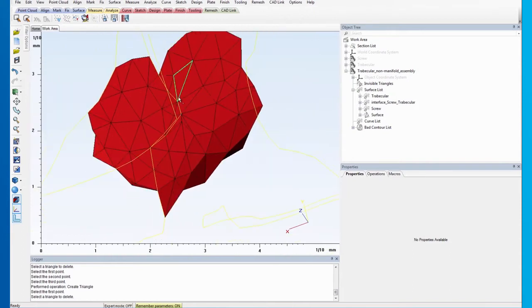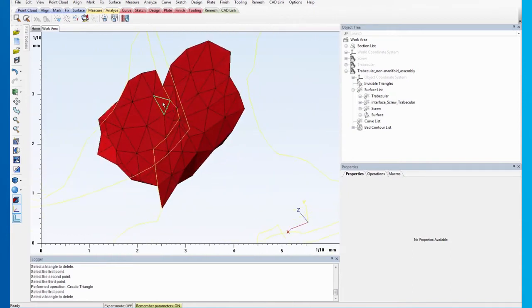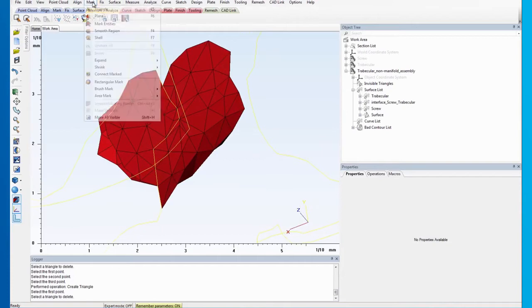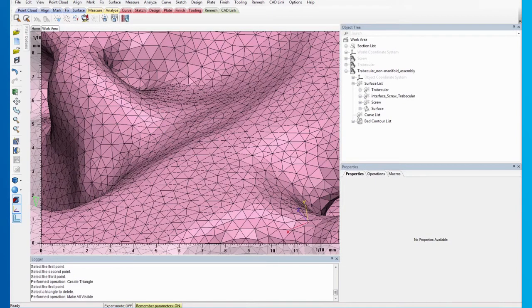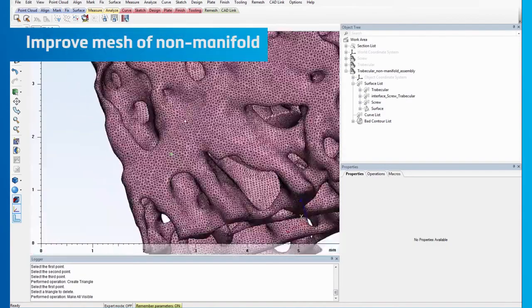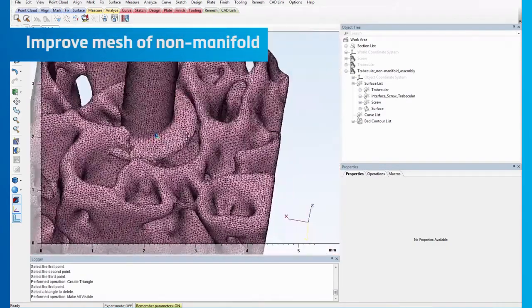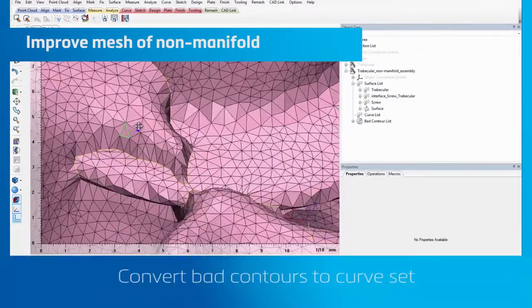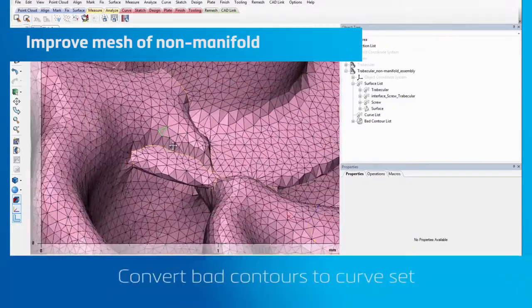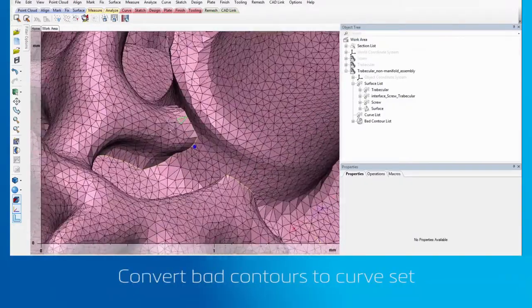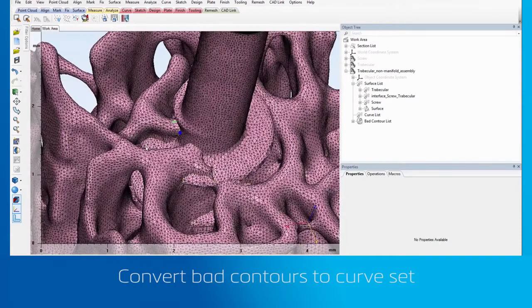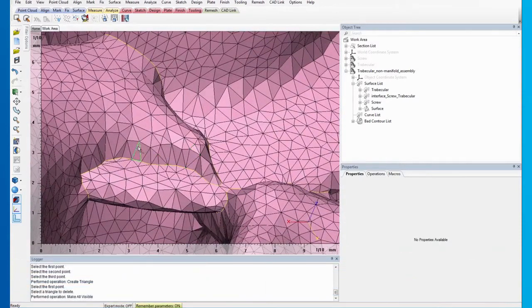Before we continue, go to the Mark menu and click on Make All Visible to make the triangles visible again. The next step is to improve the triangulation of the mesh. Previously, the triangles of the trabecular structures, which are located at the interface, were elongated with the projection of the screw.